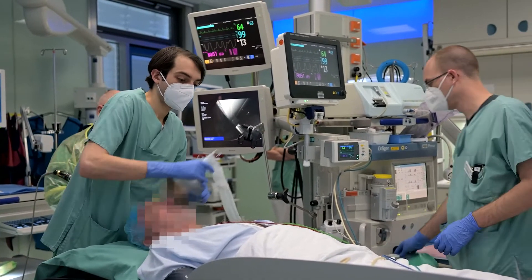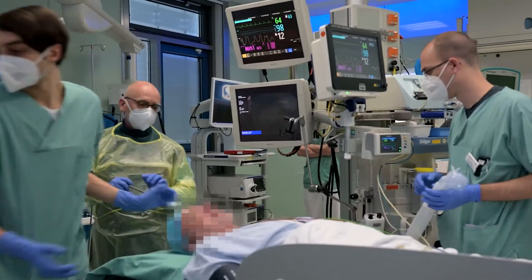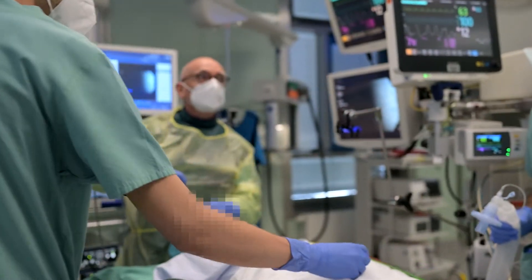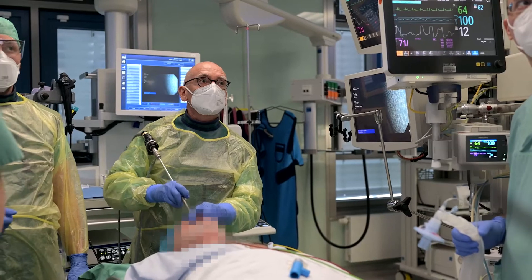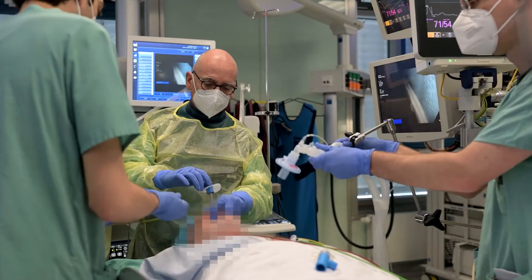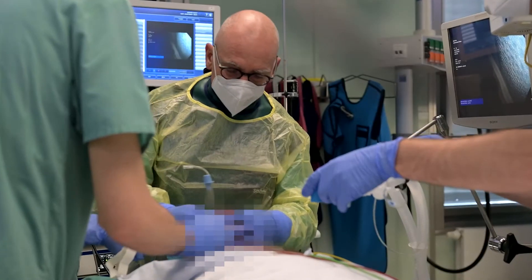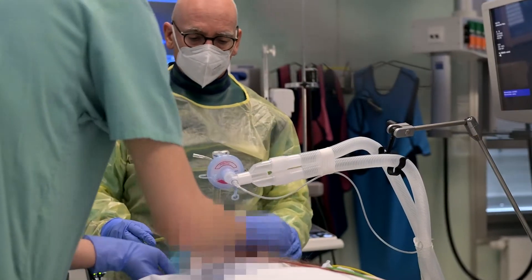After induction of general anesthesia and sufficient pre-oxygenation, the patient is brought into a supine position. Following slight reclination of the head, the rigid 30-degree endoscope with the ET tube slid over its shaft is used for direct visualization of the glottis and entry into the trachea. The ET tube remains inside the lumen while the rigid 30-degree scope is removed. The ET tube is then fixed to prevent dislodgement, and a dedicated adapter is mounted to allow ventilation and bronchoscopic access in parallel.